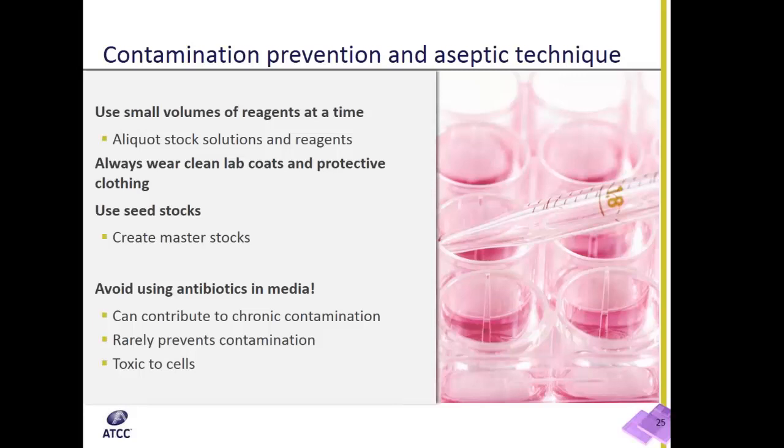To revisit, you should always avoid using antibiotics and antimycotics in culture. There are a few reasons in addition to the potential for toxicity. If you use media with no antibiotics or antimycotics and a contamination enters your cell cultures, chances are it will be visible within a few days. You can then destroy and discard the infected dishes. However, if antibiotics are present, they may slow the growth of the contaminant, allowing you to further passage and freeze down your cell lines. In short, you may be saving large amounts of contaminated cells that can cause problems further down the road.